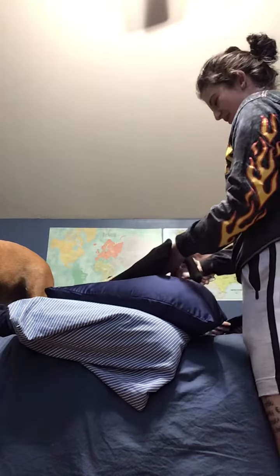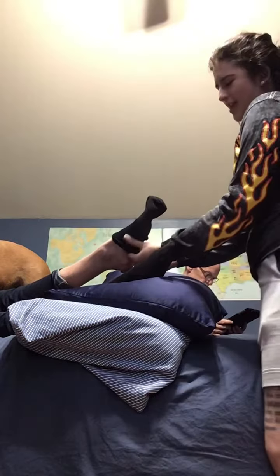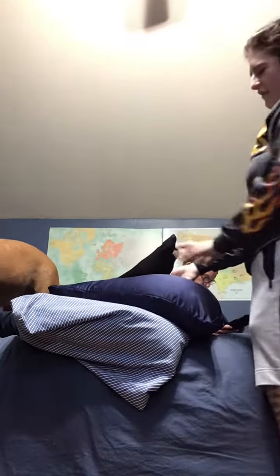Again checking the skin beforehand, making sure it's dry, and having her stocking all the way rolled up helps.